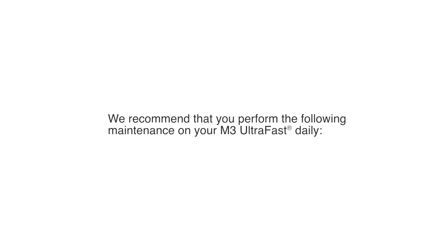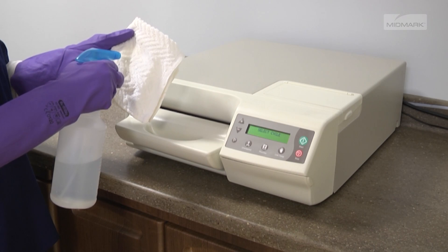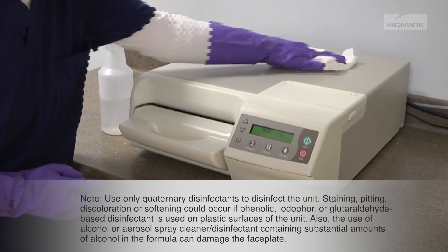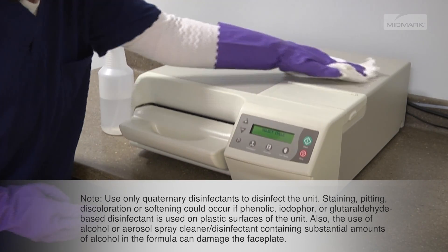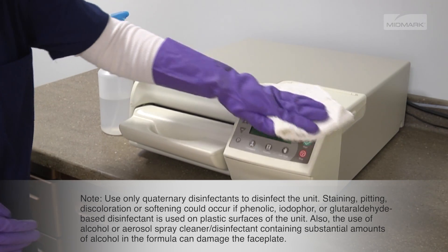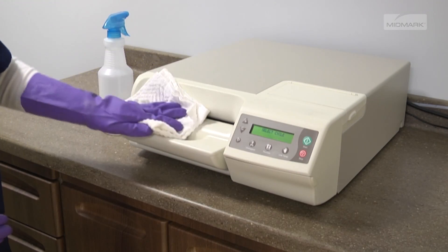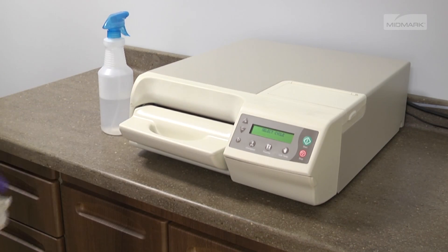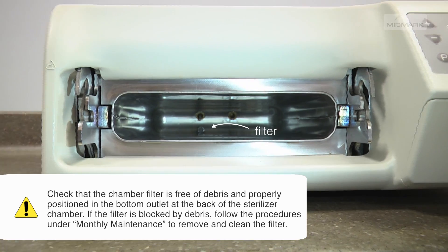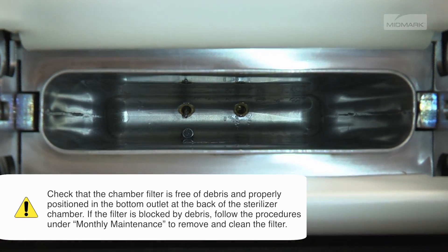We recommend that you perform the following maintenance on your M3 UltraFast daily. Wash the unit according to your facility's procedure for clinical contact surfaces. Using a soft cloth, wipe all external surfaces — be sure to wring excess solution from the cloth. Do not rinse or dry external surfaces. Allow the germicidal solution to air dry. Check that the chamber filter is free of debris and properly positioned in the bottom outlet at the back of the sterilizer chamber.